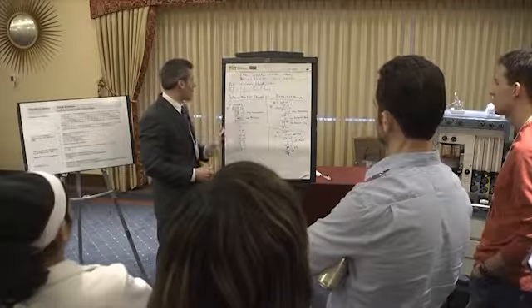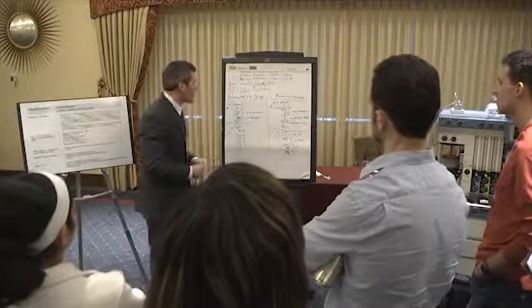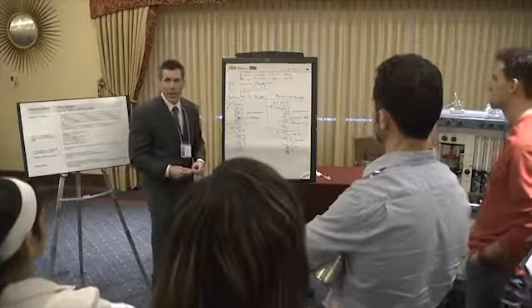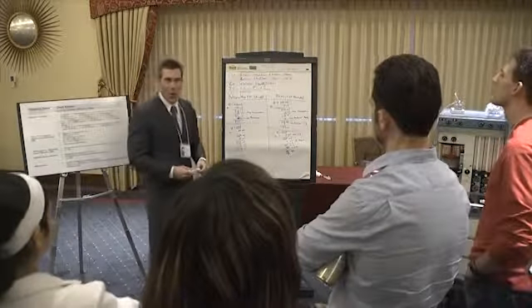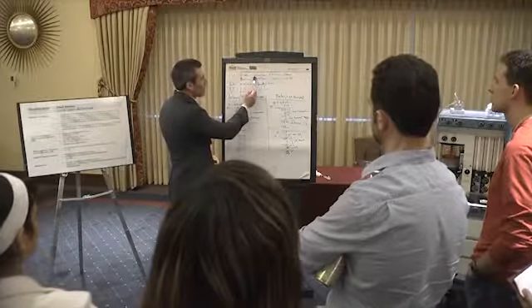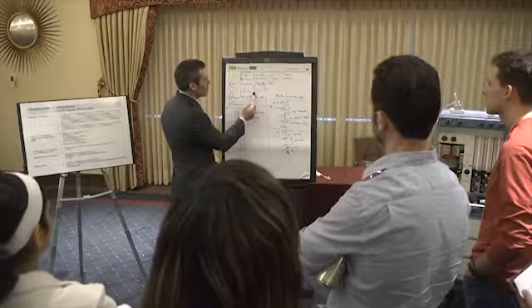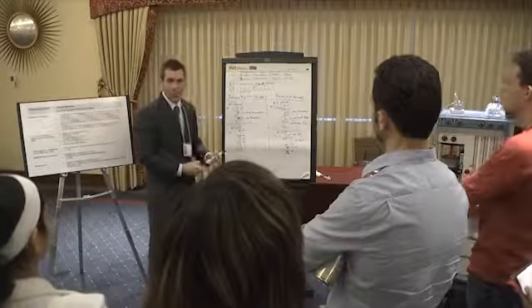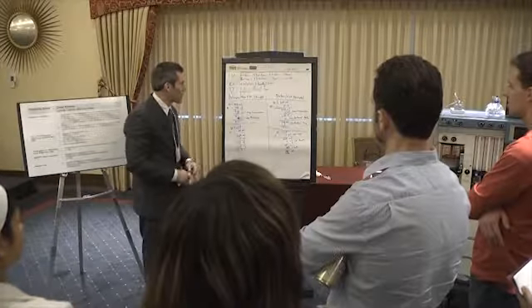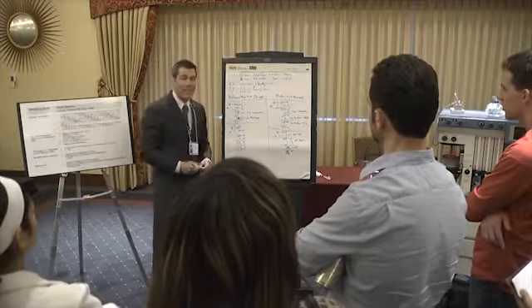So with a tidal volume of 600 on the bellows non-fresh gas flow decoupled machine at 8 liters a minute, when you start the case or when your patient has trouble and you want to turn on the oxygen, you're going to add 266. That's 133 times 2, because you're in I for 2 seconds. It's 133 per second, so that's where the 266 comes from. So now you're giving 866.